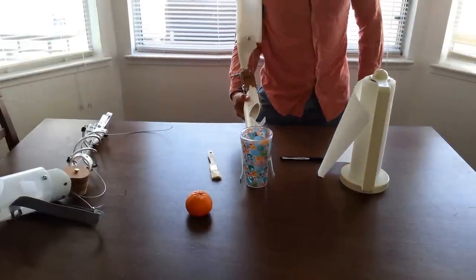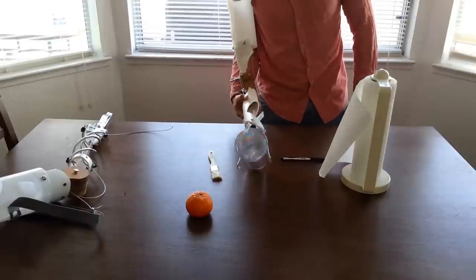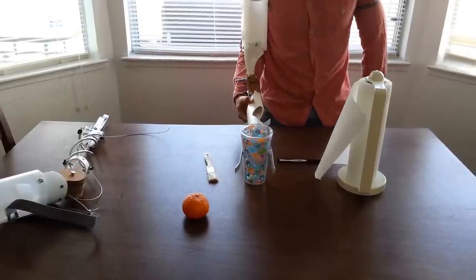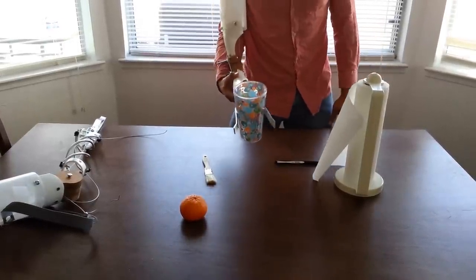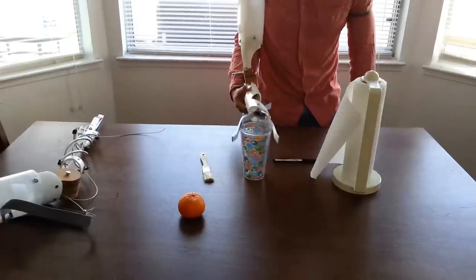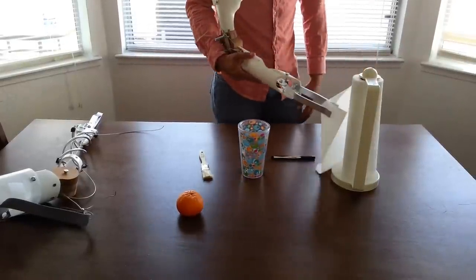And then you can also grab cups. So it adjusts to different openings. There you go. So you're able to grab stuff without tipping the water. It adjusts to different openings which is pretty good. You're able to grab small items like paper towels.